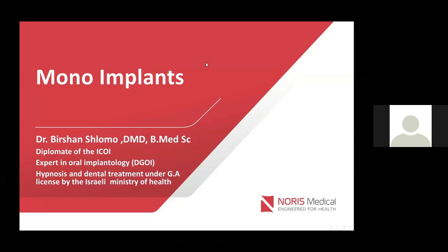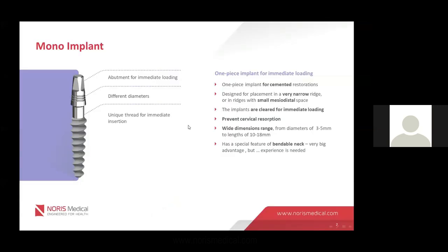So what I'm going to do today is to talk about the mono implants. Actually, it's a narrow topic. It's a narrow implant also. But it's an implant that was designed for narrow ridges, but is being used for many applications. And what I'm going to do today is to speak about its application in various spheres within the dental field.